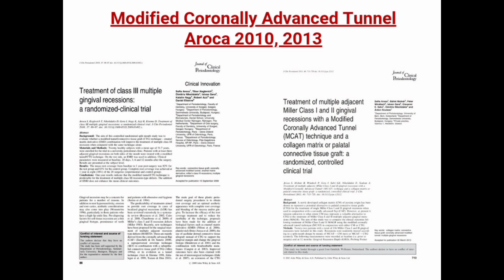In both these techniques, the first step was to make an intrasulcular incision using a microsurgical blade, and in the second step, tunneling knives were used to raise the gingivo-papillary complex in a full thickness manner without dissecting the papillae.